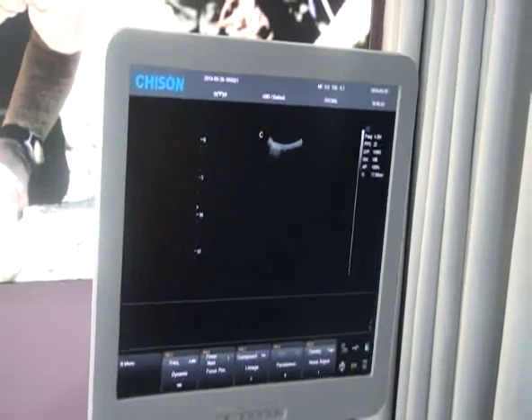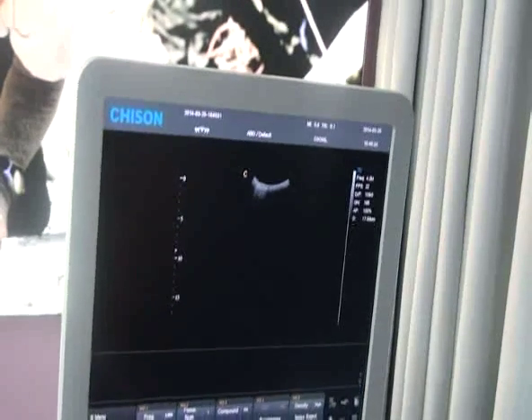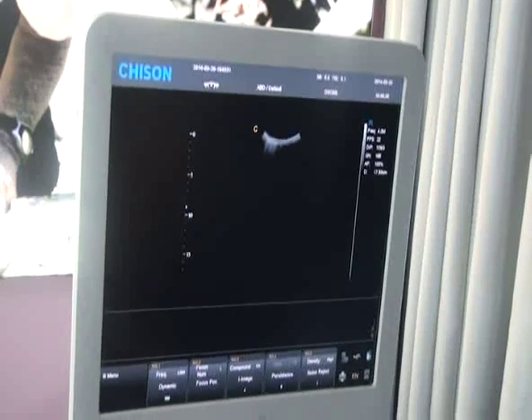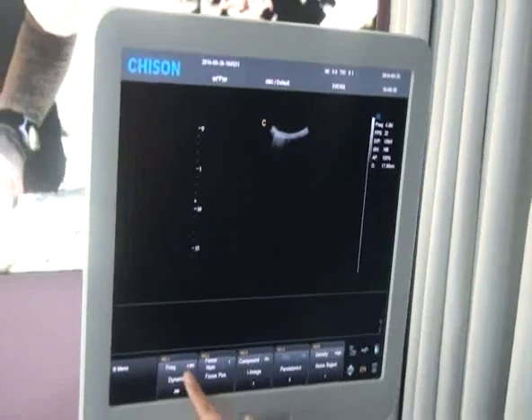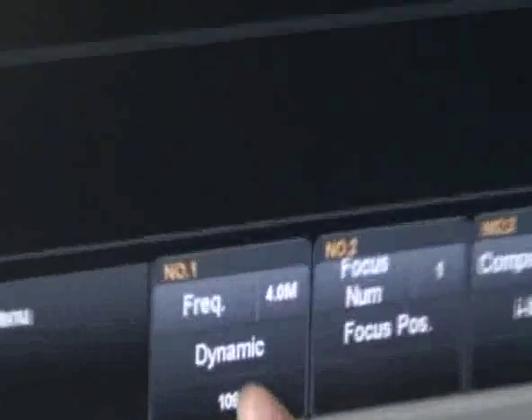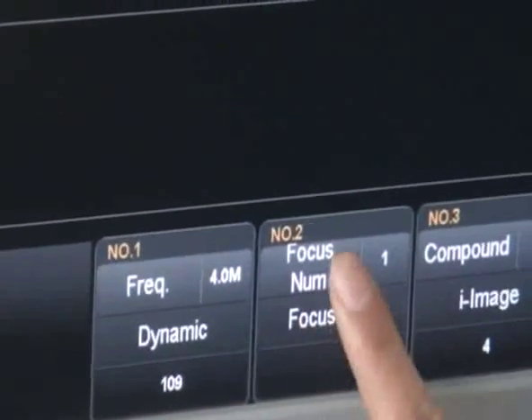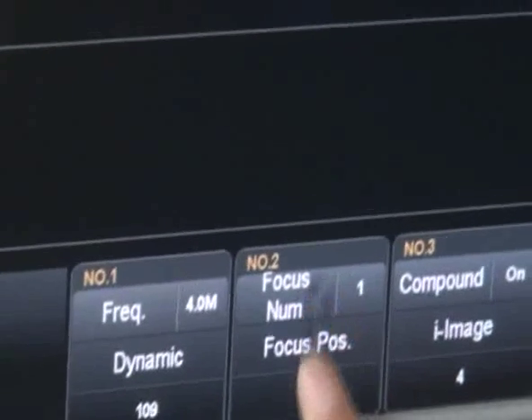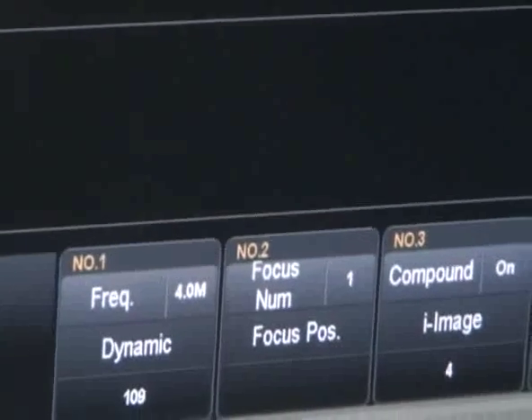In B mode, we have many parameters to adjust, but the most important are frequency, dynamic, focus number and focus position, depth, and gain.